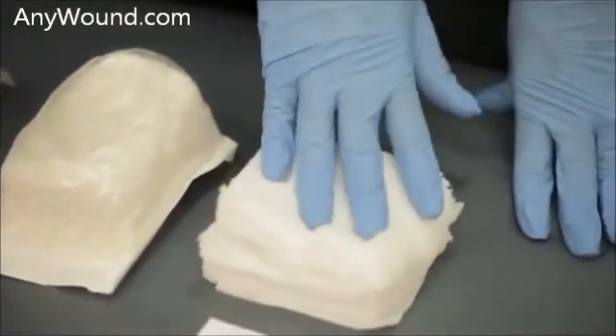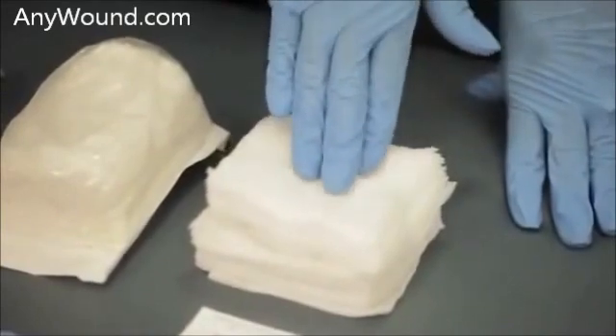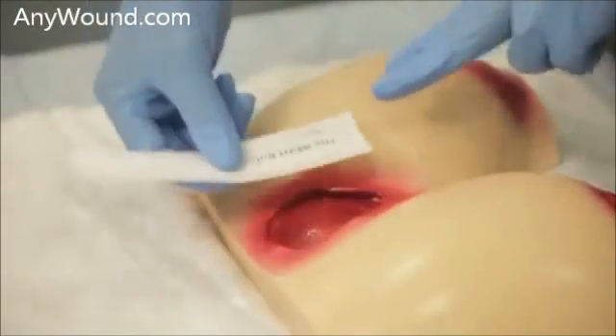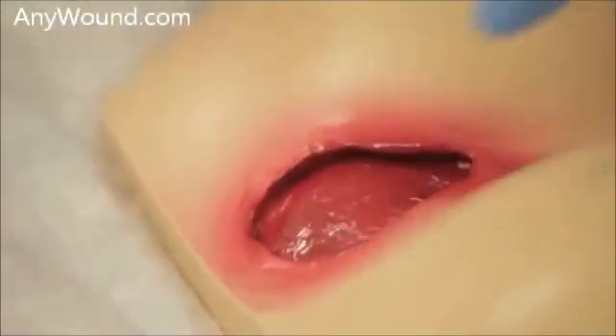These are our gauze that will be used to either secure and adhere the dressing against the wound bed, and then our measuring to determine the size of Enluxtra that will be needed. The first thing we will do is measure the size of our wound — 6 centimeters by 4 and a half centimeters.